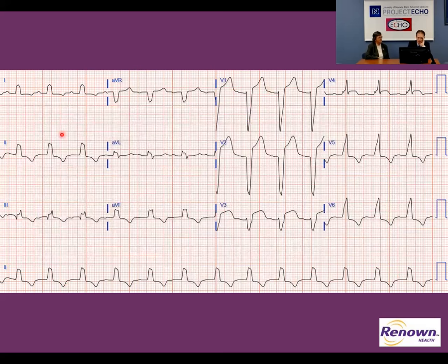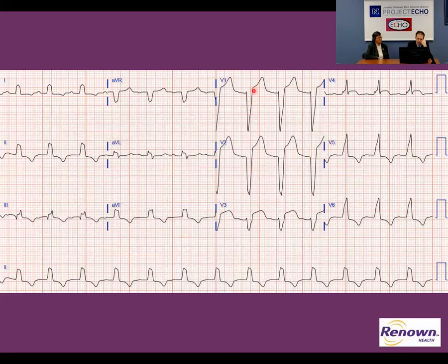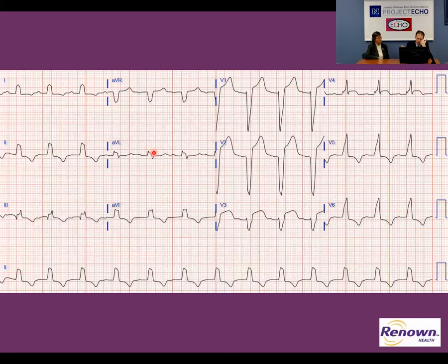Intervals: the PR interval is defined as normal at less than 200 milliseconds or one big box. This is first-degree AV block because it is just barely more than 200 milliseconds. The QRS is wide and downgoing in V1, upgoing in V5, V6, lead one, and AVL — that's consistent with left bundle branch block. There's no great validated criteria for left ventricular hypertrophy with left bundle branch block, so the criteria sort of fall apart with the bundle branch block.